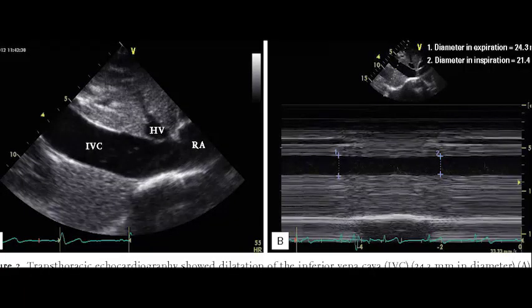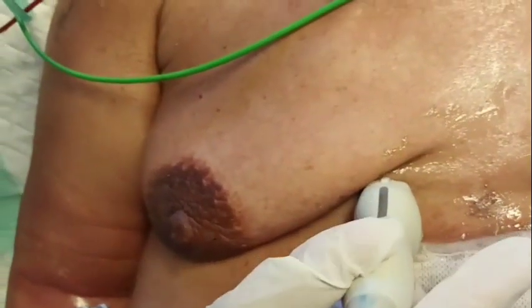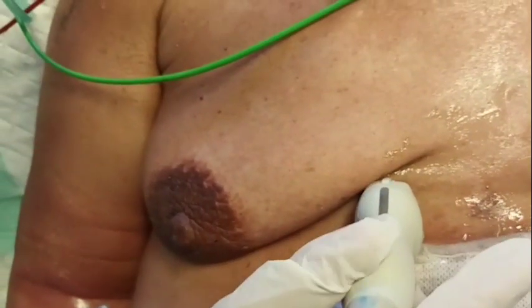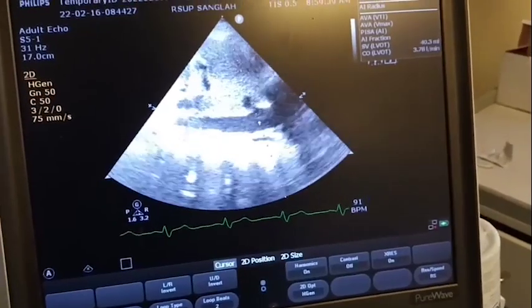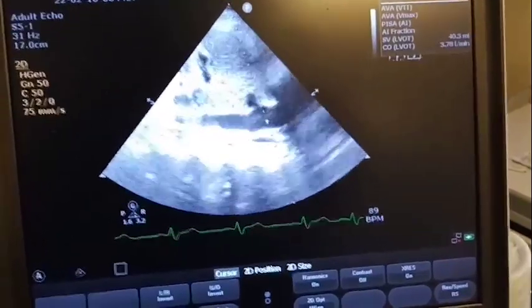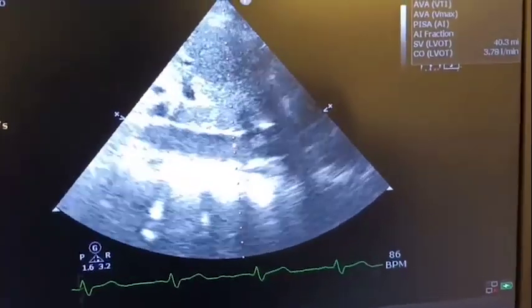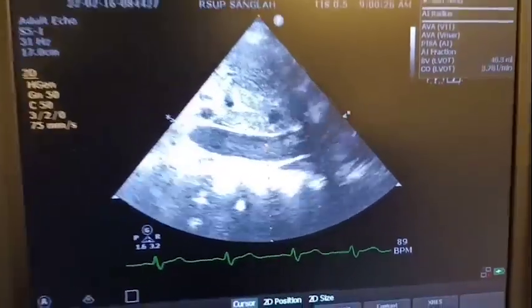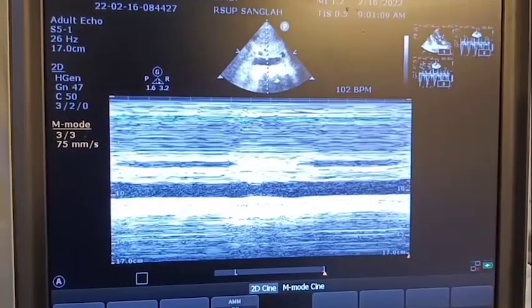Last step: approach the subcostal view. The probe is placed under the xiphoid process with the marker pointing to 12 o'clock. Then the probe is directed to the right side so that an image of the inferior vena cava appears. On the screen, we will see the right atrium, inferior vena cava, and hepatic vein. Next, we select the M-mode to measure the diameter of the inferior vena cava and the collapsibility index.